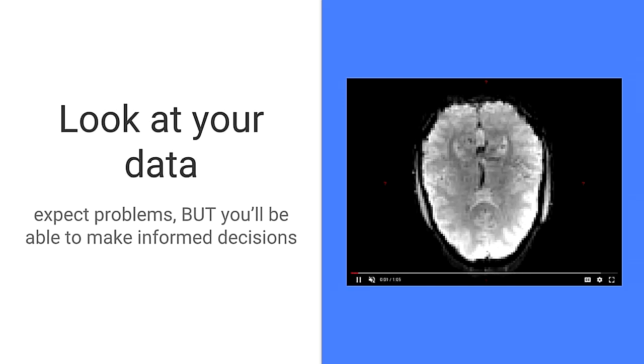So yeah, wrapping up, the most important tip here is look at your data, and I wanted to show you this blinking brain because of susceptibility and inhomogeneity. So yeah, it's really blinking. And that's a ghost from the eyes.